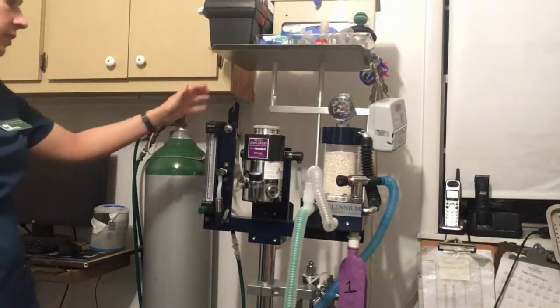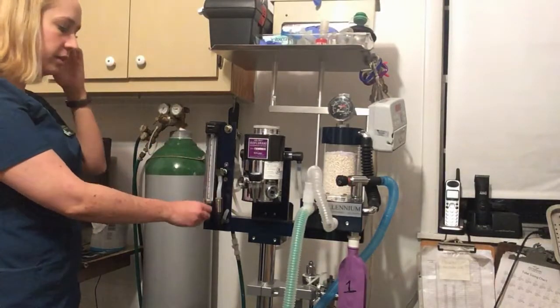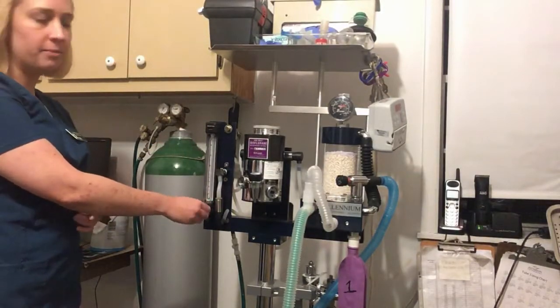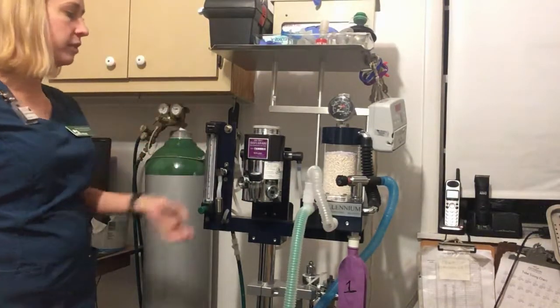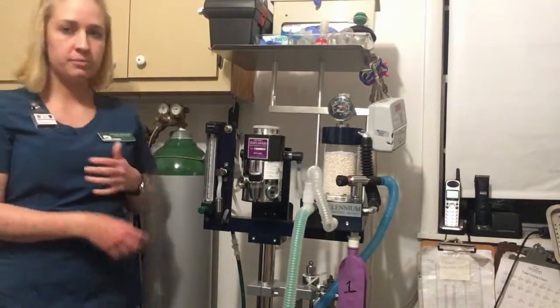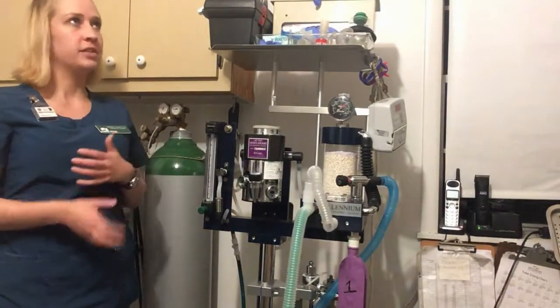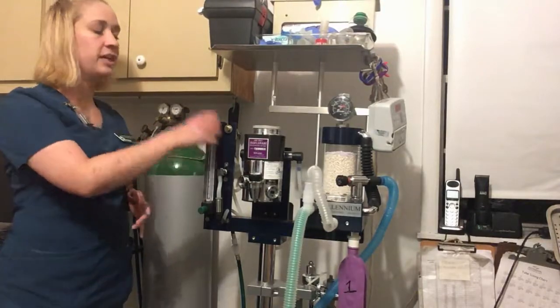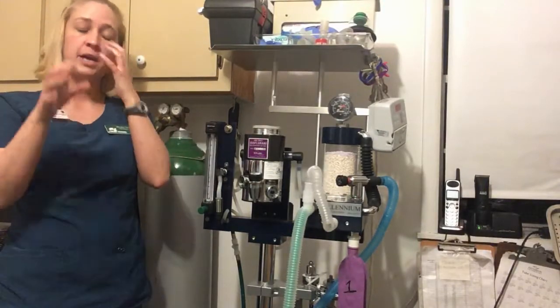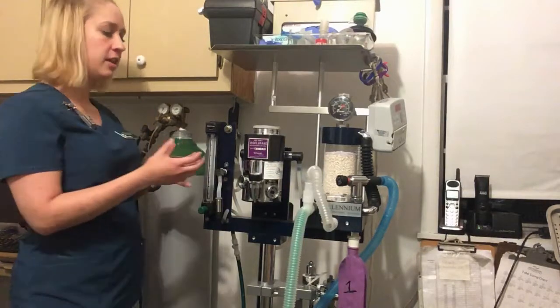So this is our flow meter. You'll turn this knob to increase and decrease the amount of oxygen that is flowing through the system, to make sure that the different size patients are getting the correct amount of oxygen. The more oxygen that is flowing through the system, the faster the patient will get the anesthetic gases.